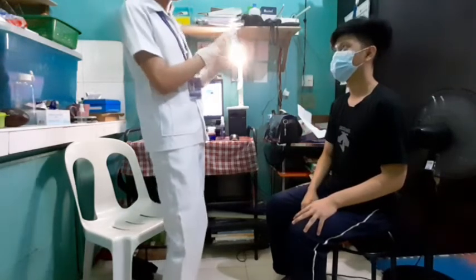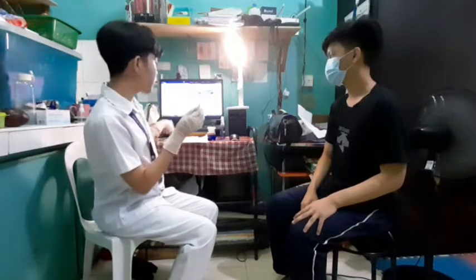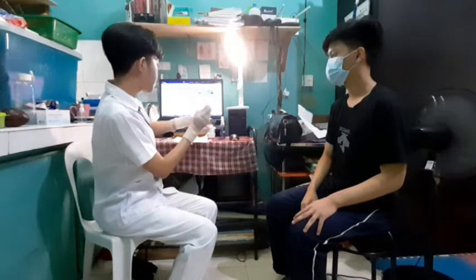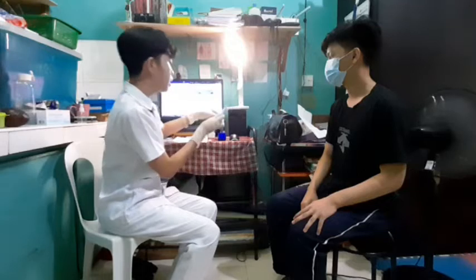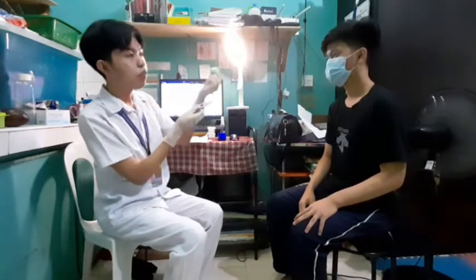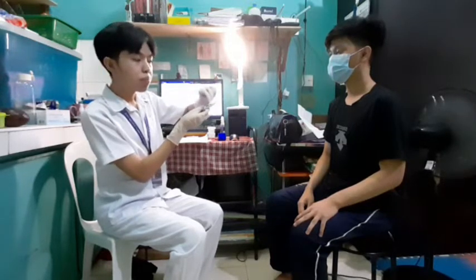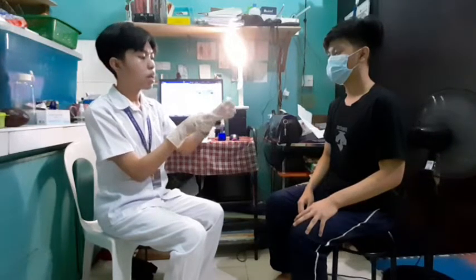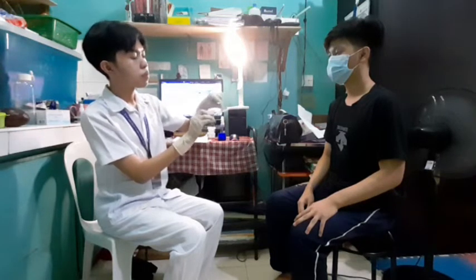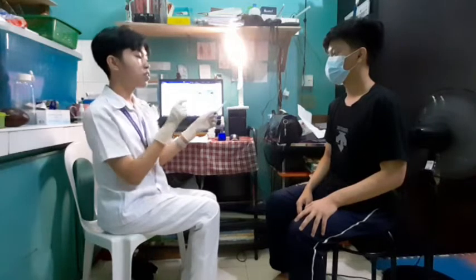With my gloves on, I will now start assessing the temperature. Before inserting the thermometer inside the client's mouth, I will first disinfect the thermometer using alcohol swabs. To clean the thermometer, simply grab your alcohol swab. The technique is to swipe the body of the thermometer first and then with a firm circular motion down to the probe. I'll now discard the cotton. I'm done sanitizing the thermometer — I'll wait a few seconds for the alcohol to dry.